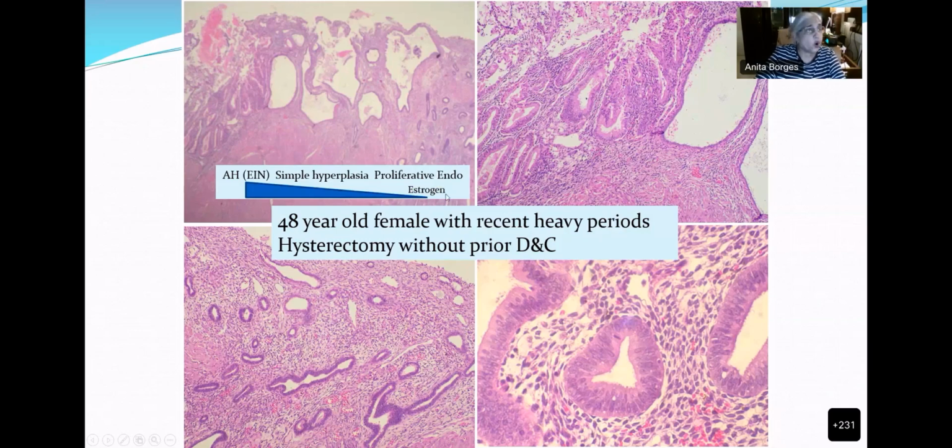And if you want to draw the estrogen response of these different parts of the endometrium, here, zones that you are seeing to estrogen, you can see that this has responded to estrogen in its normal fashion. This is showing hyperplasia, and this is showing atypical hyperplasia and EIN. So Mansi, you can see a transition, right?